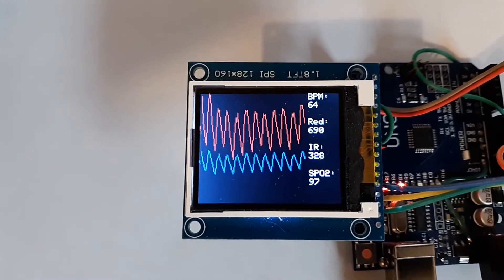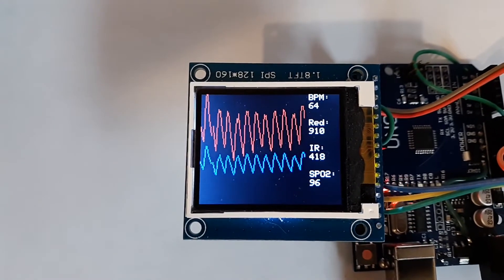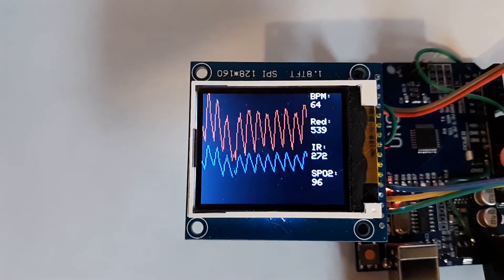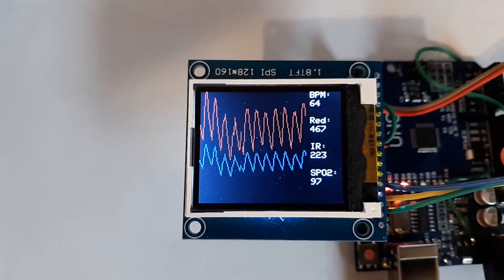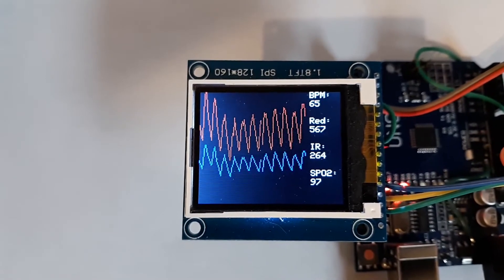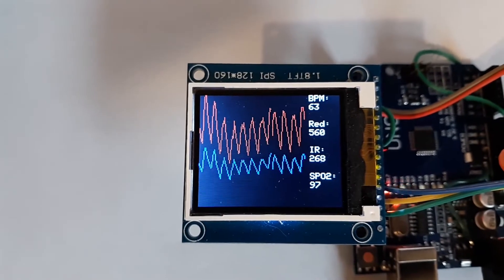There you see it's getting close - 96, 97 - but there's still, oh wow, there's a big shift. Well, it stayed with it.